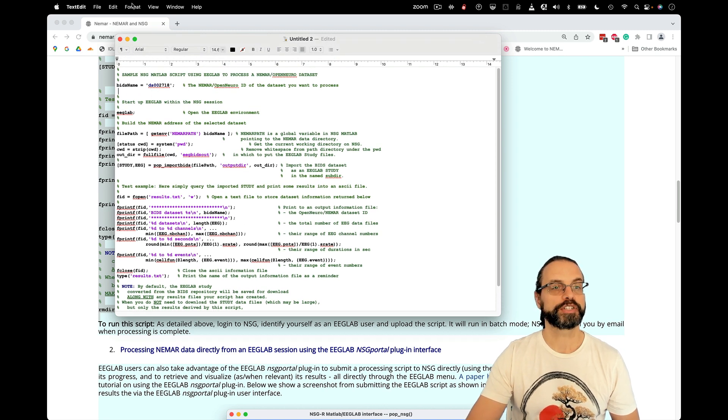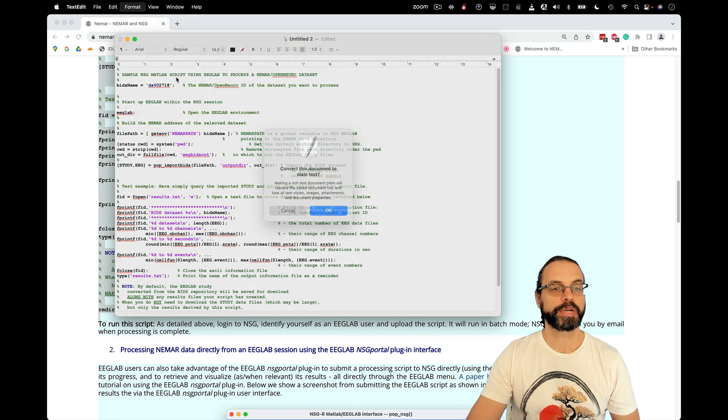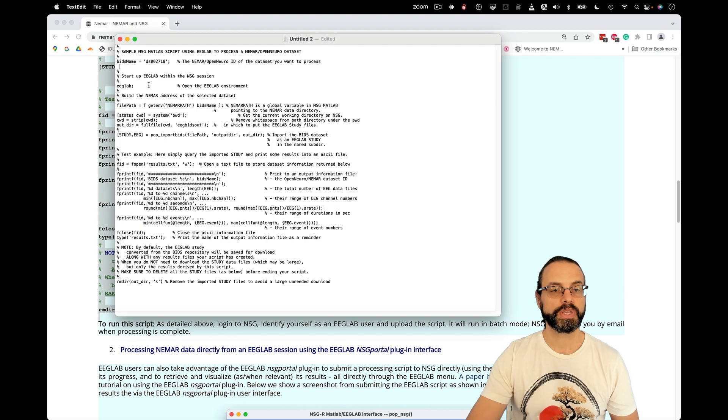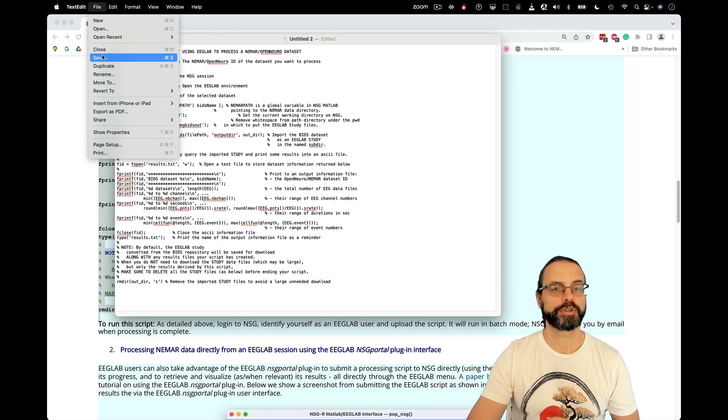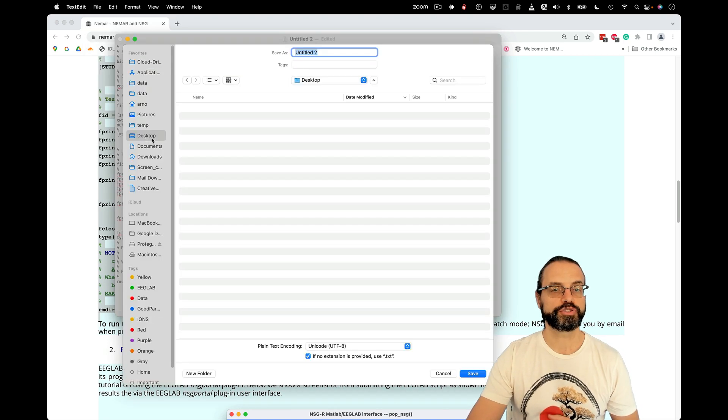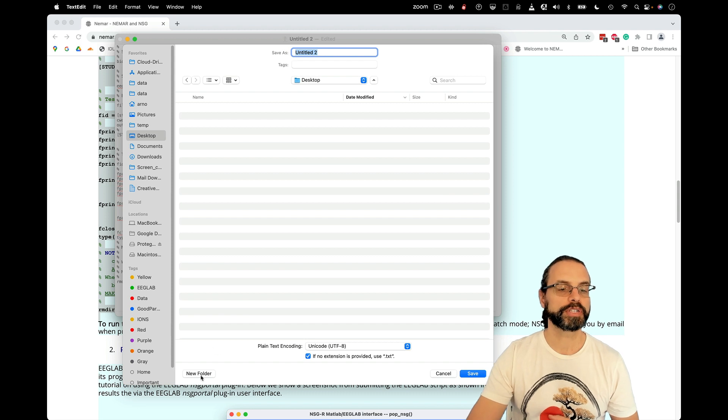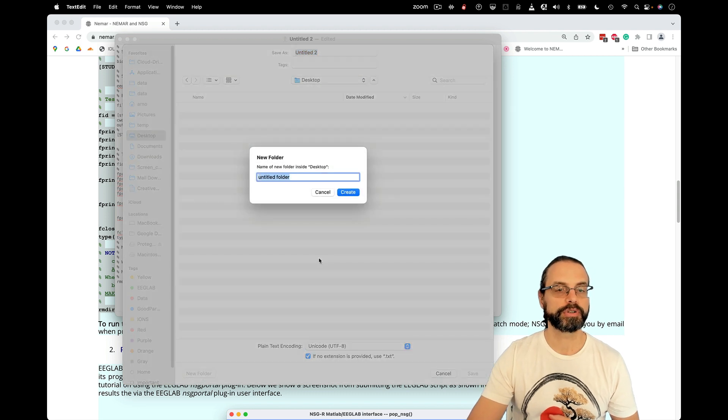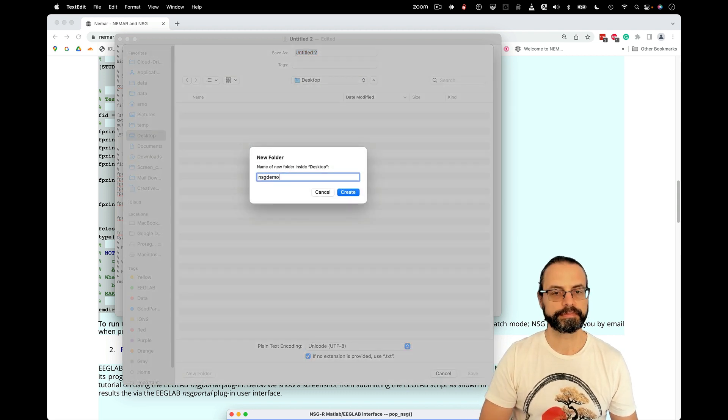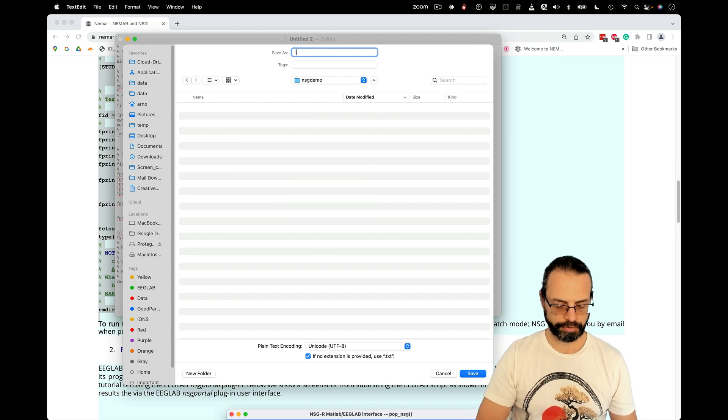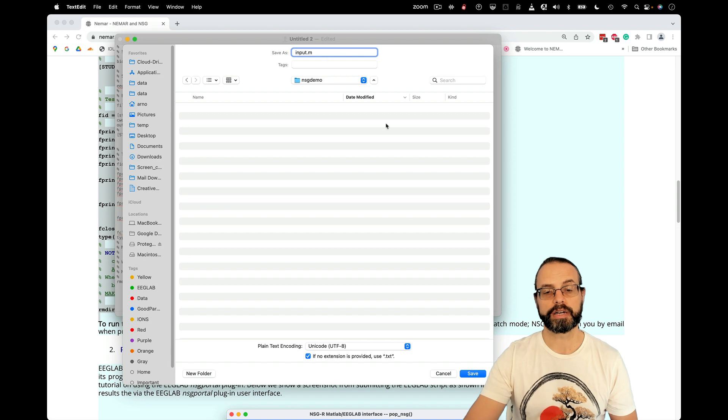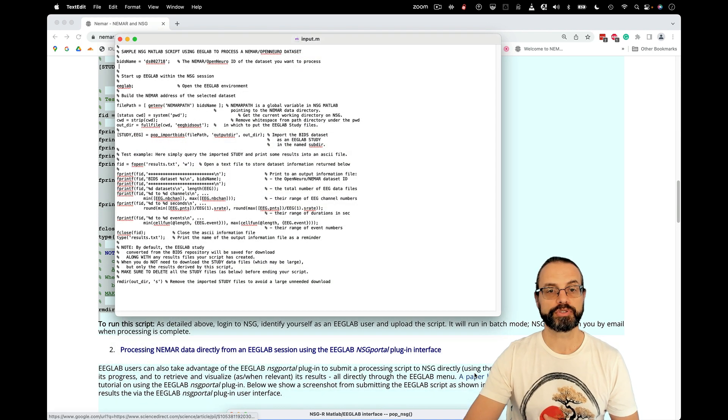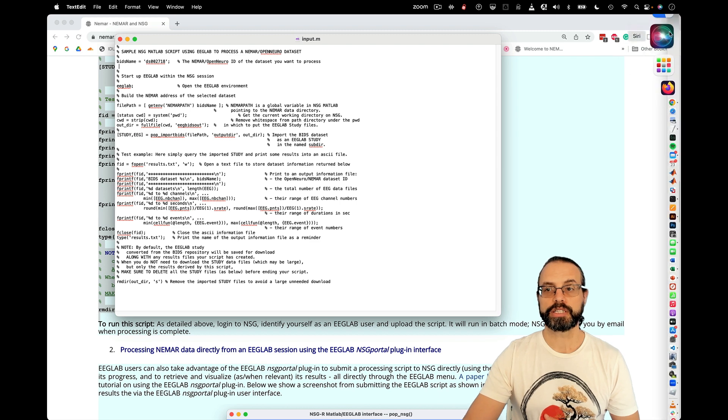But here, this should work. So I'm going to make this plain text because I don't want to save it in Word format, for example. And I'm going to save it to be able to run it on the supercomputer. Here, I'm first going to create a folder, NSG demo. And I'm going to call this script input.m, which is the default on the NSG. So I've saved a script and I'm ready to upload it.